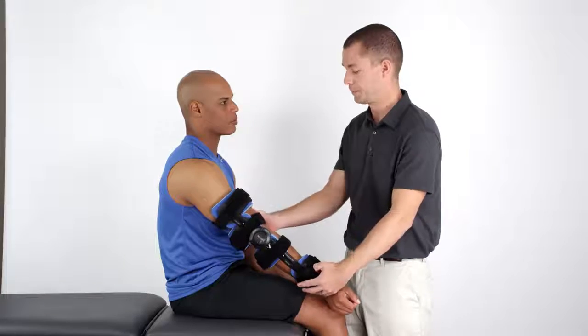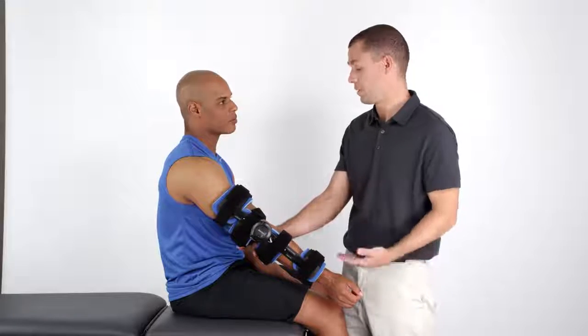The advanced orthosis now provides a dynamic stress on the elbow joint.